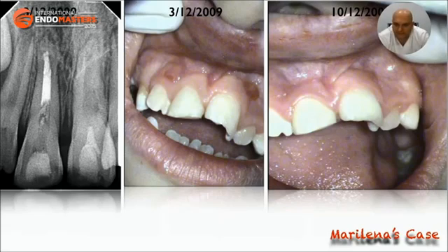However, in the left maxillary central incisor, upon assessing the wide canal, vital tissue was found in the middle third of the developing root. Insertion of a file through a small access elicited a painful reaction from little Marlena from the level of the midroot. Disinfection was achieved with 2% chlorhexidine rinsing up to the level of the vital tissue. Bleeding was induced from this level and MTA was placed over the blood clot at the site of my access cavity. 1 week later, both sinus tracts disappeared.